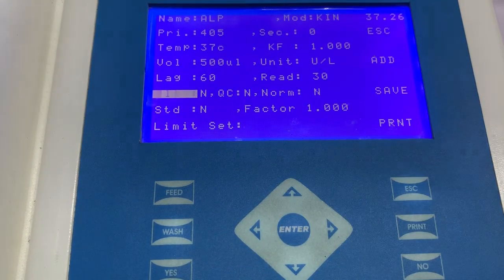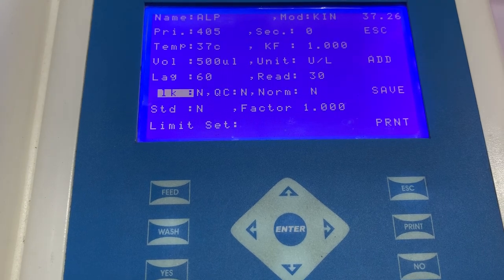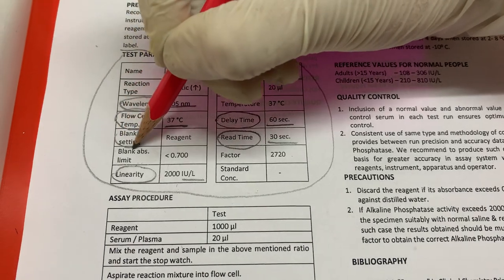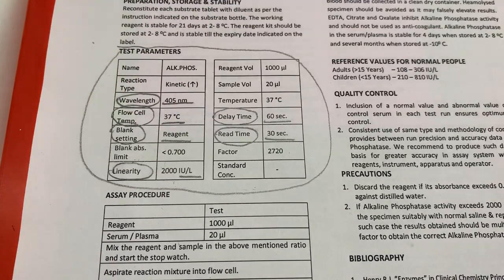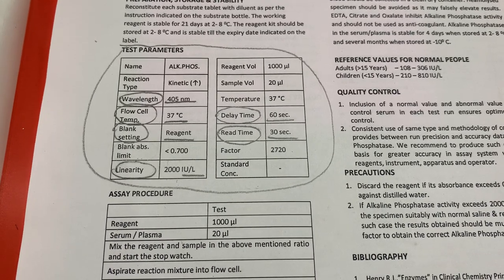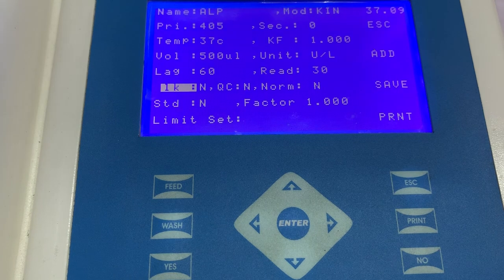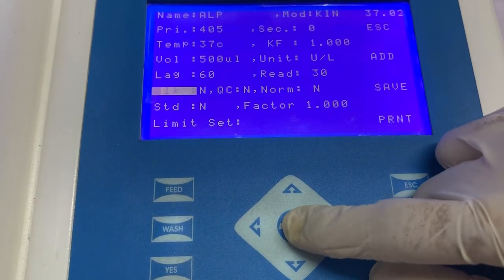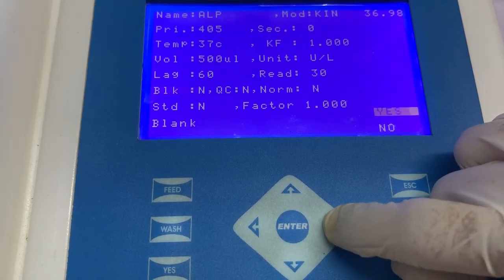The next information that needs to be entered is of blank settings — whether reagent or distilled water is to be used for blanking. This information can also be seen in the instructions for use, where the manufacturer clearly mentions whether reagent or distilled water is to be used for blanking. In this case, because reagent is to be used for blanking, we will select the option of blank and then select yes.